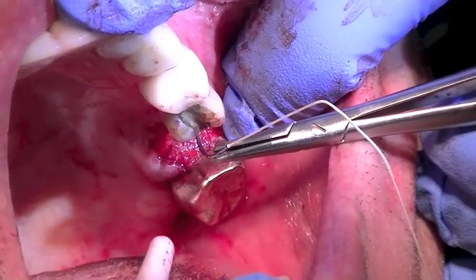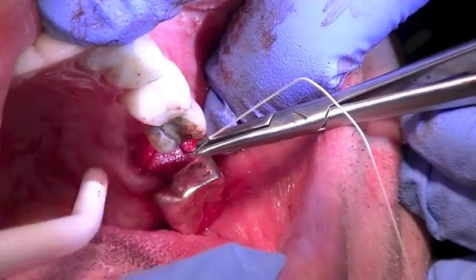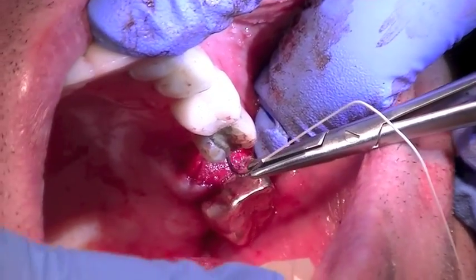Placing the suture, I'm going to come from the inside, and sometimes my assistant will hold my membrane down for me.